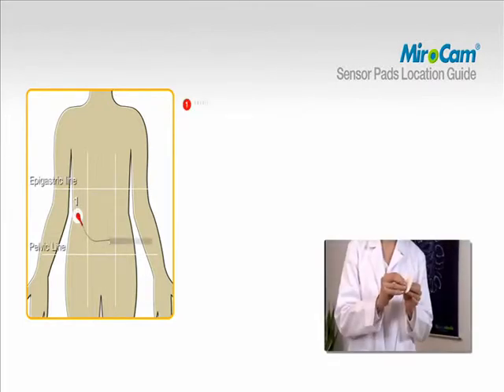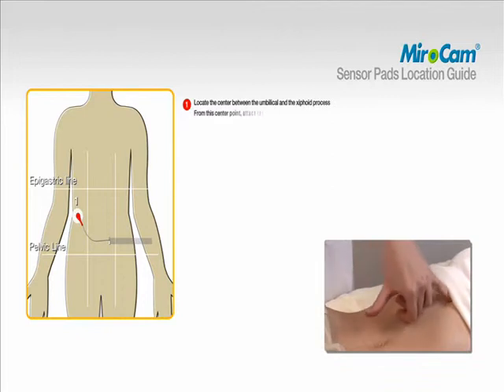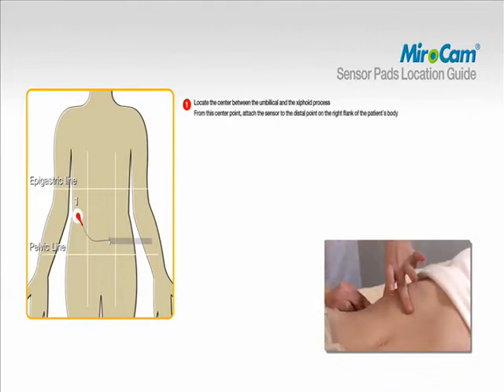Attach sensor pads according to the color and number on the data cables. To attach pad number one, locate the center between the umbilical and the xiphoid process. From this center point, attach the sensor to the distal point on the right flank of the patient's body.